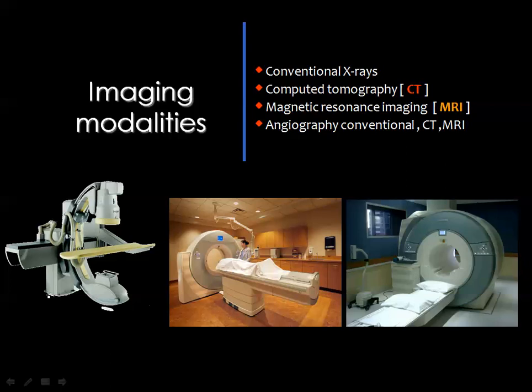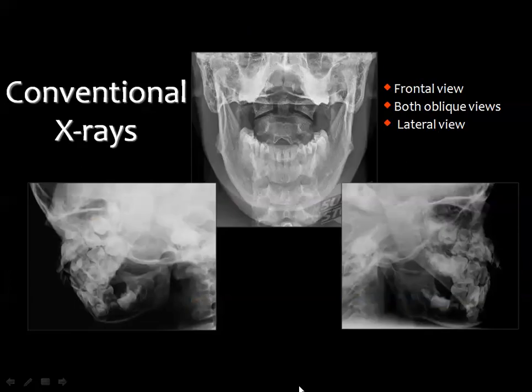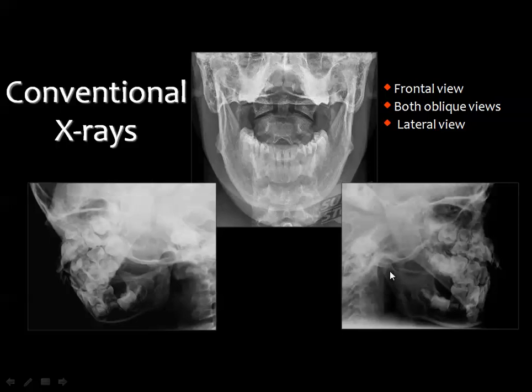The traditional way for examination of the mandible was conventional x-rays. These x-rays were obtained in the frontal view, as you can see here, and in oblique views for assessment of the left mandibular ramus and condyle, and also the oblique view for assessment of the right mandibular ramus and condyle.